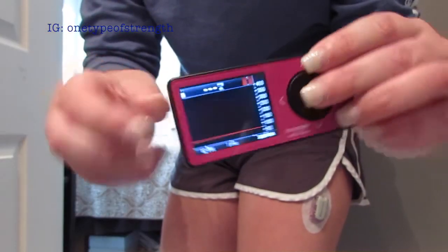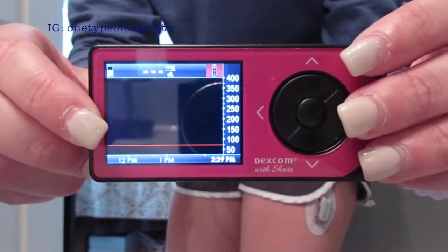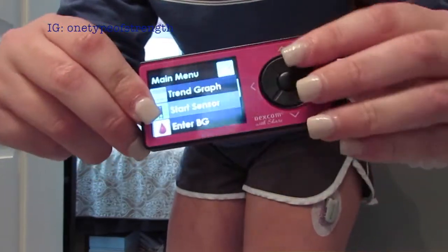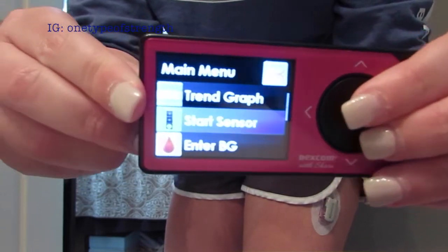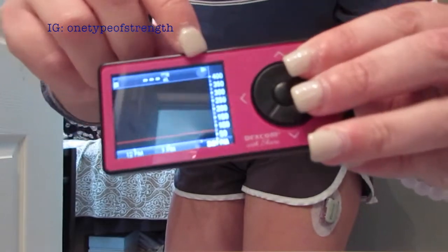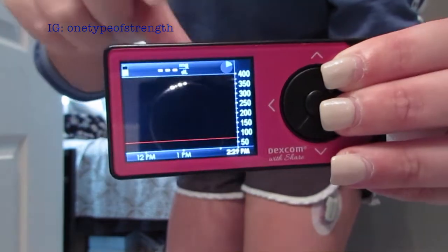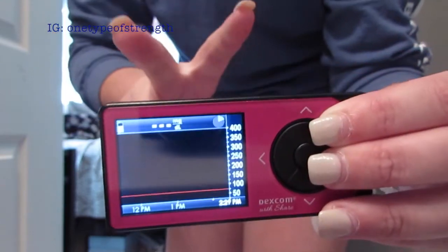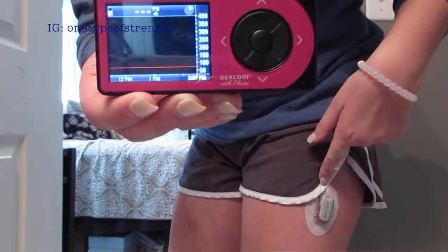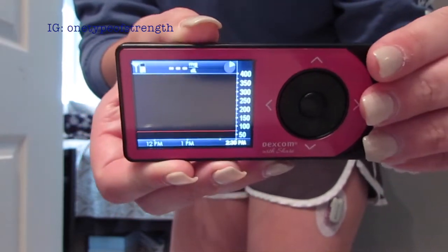Now that the sensor is inserted and the transmitter is in, I'm ready to take my receiver. Right now it has a red stop light, which means no sensor has been started. I click the middle button, go down one, and it says 'Start Sensor.' I press the middle button and now in the corner there's a pie chart timer. It takes about two hours to start the sensor up and running — then it will prompt you to enter your blood sugar two times and it will start running. I just need to keep the receiver close to the transmitter for about two hours, and then the pie chart will turn green when it's ready.